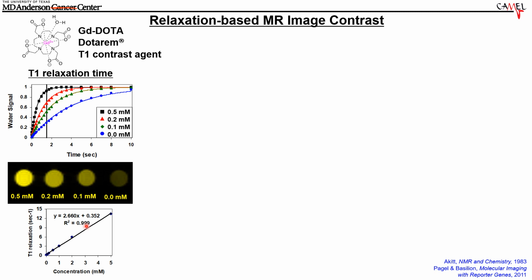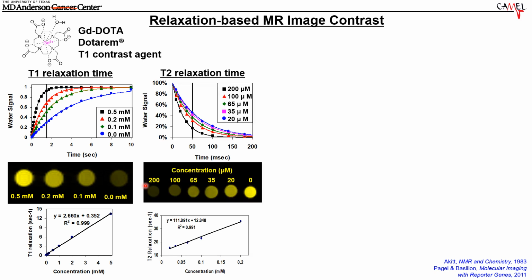And so now we can effectively measure the concentration of agents, although there are some assumptions along the way that compromise this quantification. Therefore, we can inject agents and measure how much they are in certain organs. And they do tend to collect in tumors, which then lights up the tumor in the image.